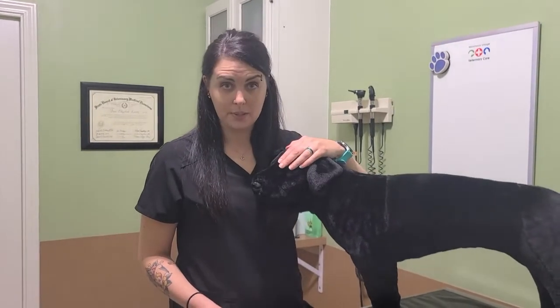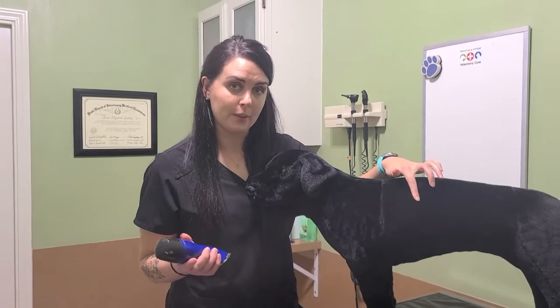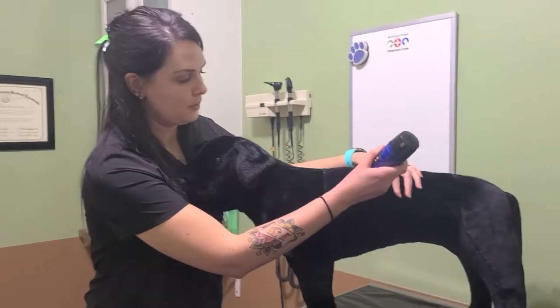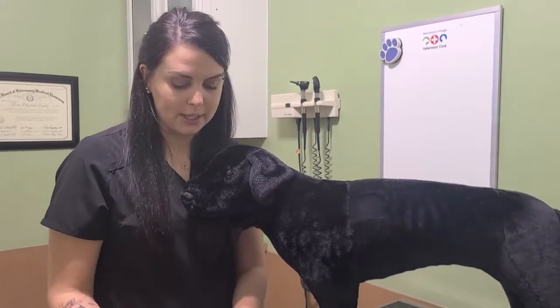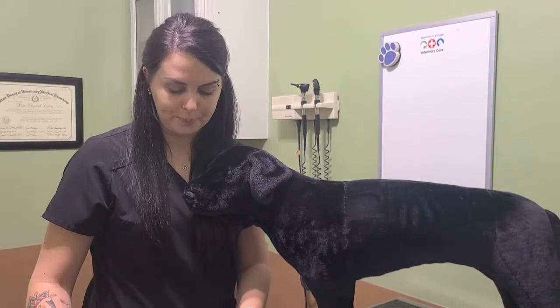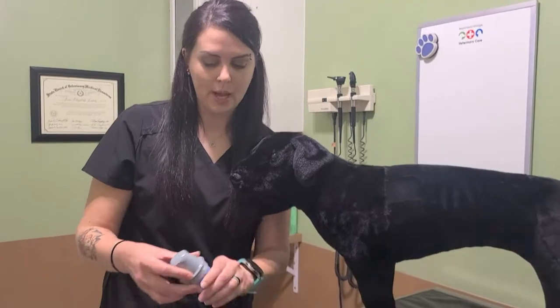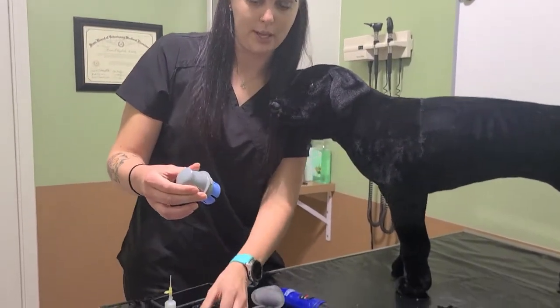Now I'm going to show you how to apply the Freestyle Libre sensor. Rover here is going to be my demo dog. We're going to shave an area right here. Another approved area is up on the top of the neck. Shaving the area helps the sensor adhere better to Rover. There is an application on your phone you can download and it has really great directions to help you.